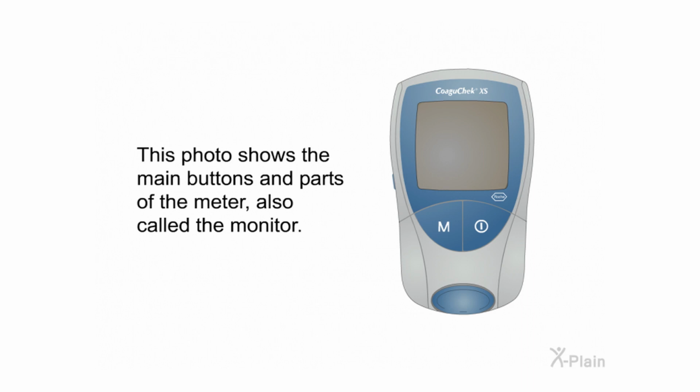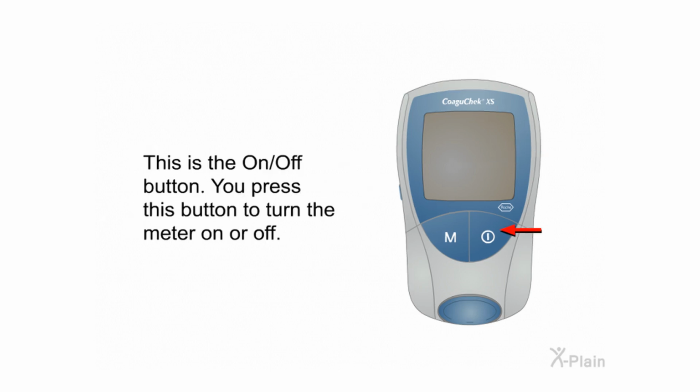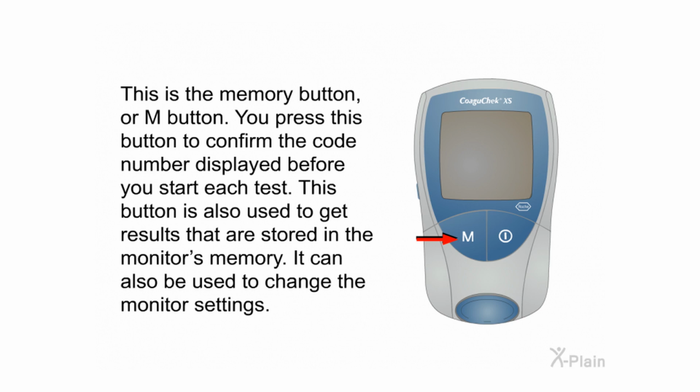This photo shows the main buttons and parts of the meter, also called the monitor. This is the display. It shows results, information, symbols, and results that are stored in the memory. This is the on-off button. You press this button to turn the meter on or off. This is the memory button, or M button. You press this button to confirm the code number displayed before you start each test. This button is also used to get results that are stored in the monitor's memory. It can also be used to change the monitor settings.